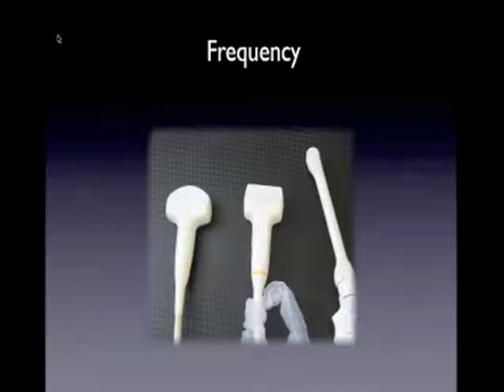In the center of the picture is a high-frequency linear array probe, meaning frequencies between 5 to 10 megahertz. High-frequency probes have excellent superficial structure imaging and poor penetration to visualize deeper structures. These probes are great for imaging superficial structures like lung, vasculature, and soft tissue.